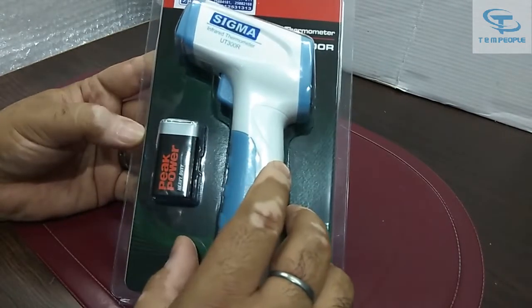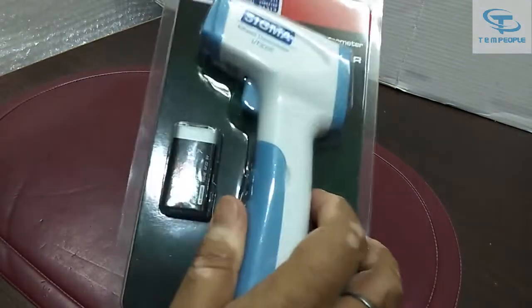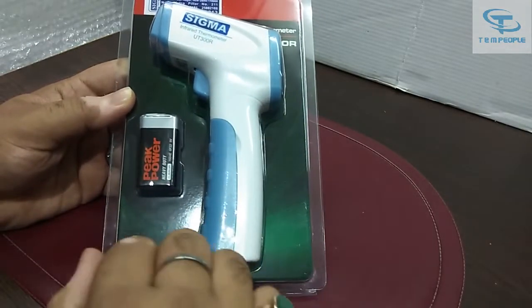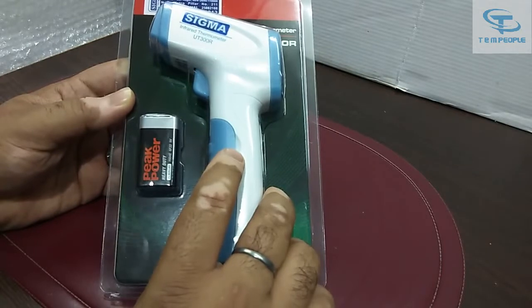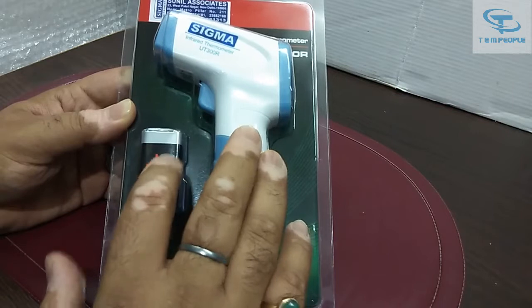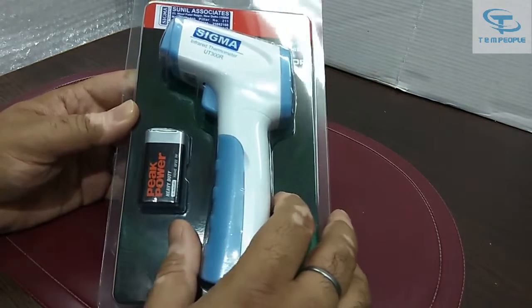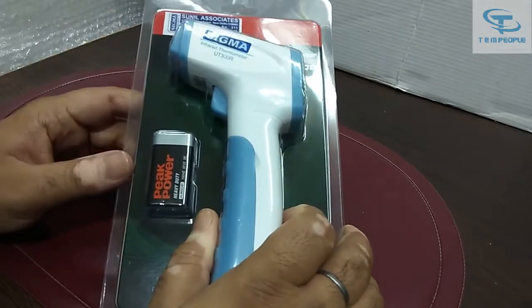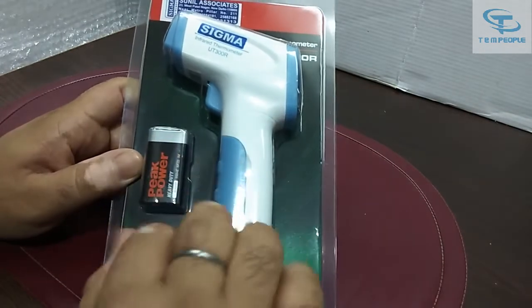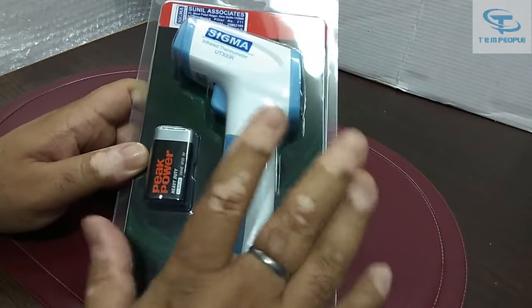There are normally different types of infrared thermometers available in the market. Some are used for surface parts and some are useful for body parts, but this one is for the human body. You can test the temperature of a human body because now due to COVID, lots of people are interested in buying thermometers. You have to buy these sort of infrared thermometers which can measure the temperature of a human body.